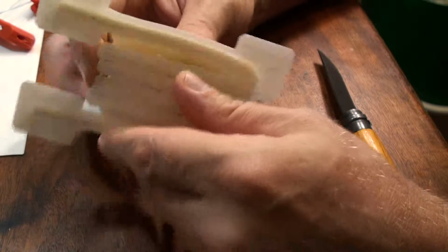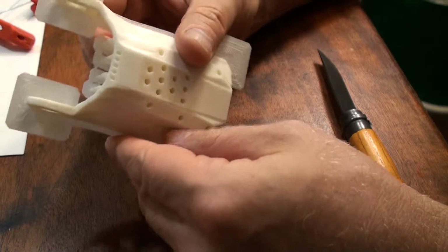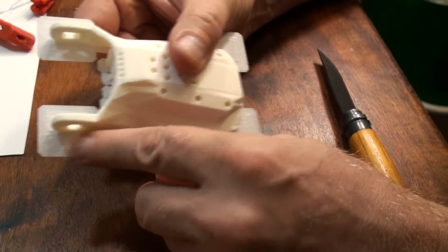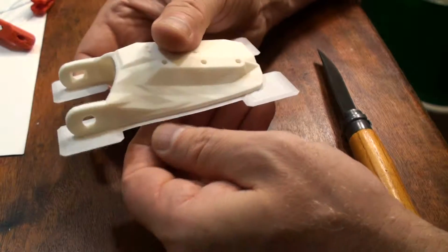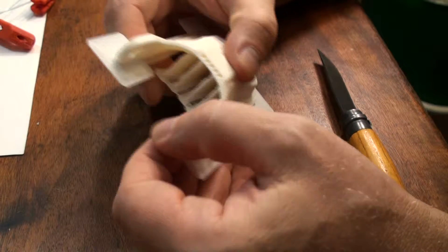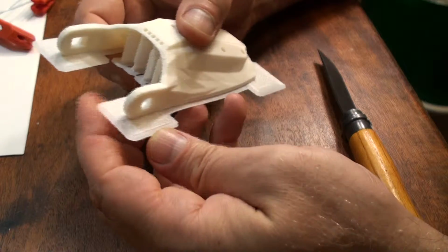When you print in PLA, you probably won't print with any kind of a brim. You certainly won't need to, especially with these pads here. So you won't see this lip around here, and these gecko feet will be somewhat smaller.